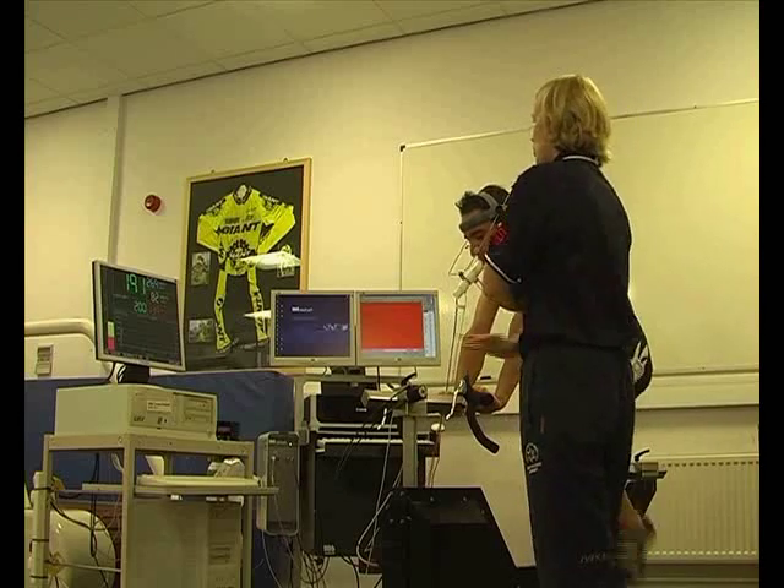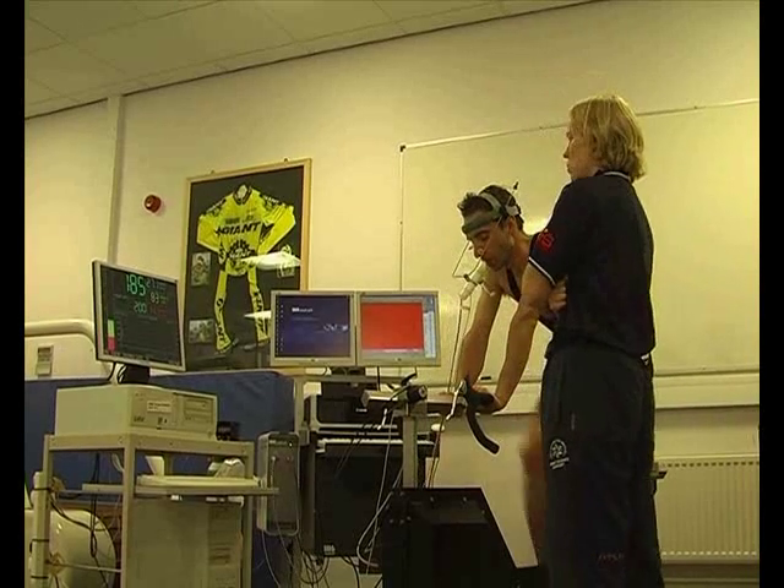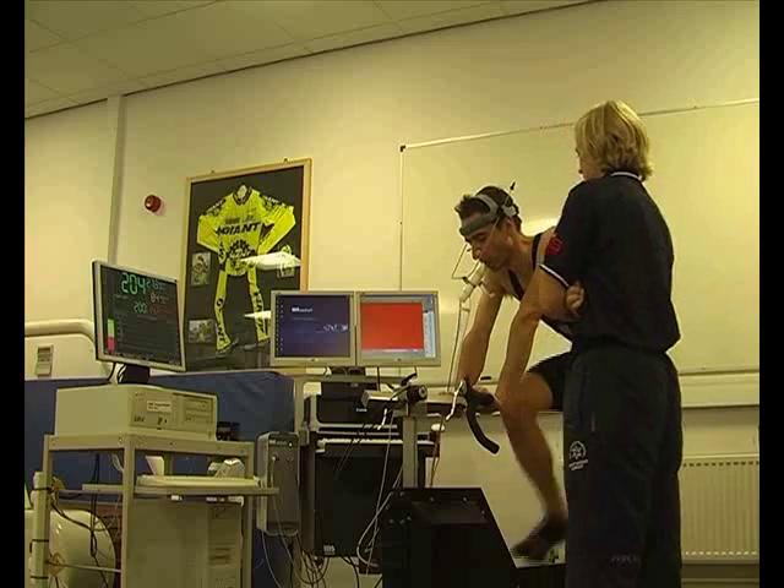The power has started to settle down now, and the athlete has just been given some guidance on what cadence to pedal at during the test. Normally around 90 to 95 RPM is good.